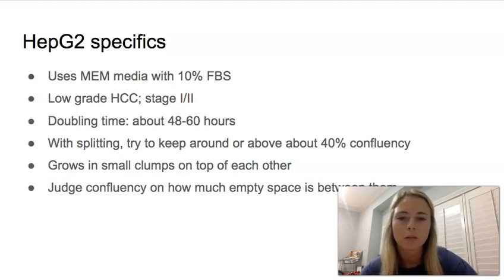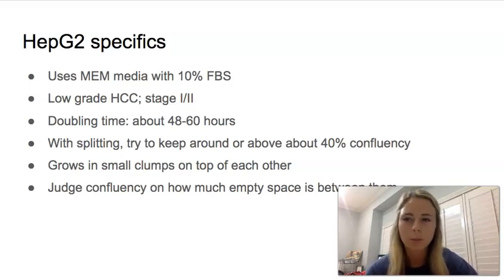When splitting these cells, try to keep them above or around 40% confluency — that's something we noticed when growing them, and also what others who had grown them said. They do grow in little small clumps on top of each other, so if they're really spread out it is a lower confluency. It's hard to judge confluency because of the clumps, so you just have to base it on how much empty space is between the clumps.